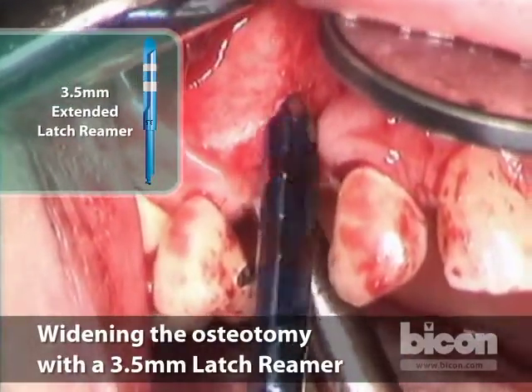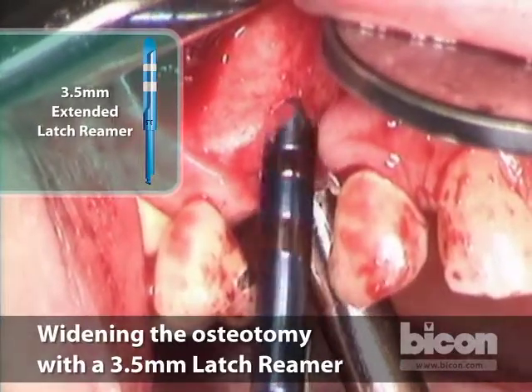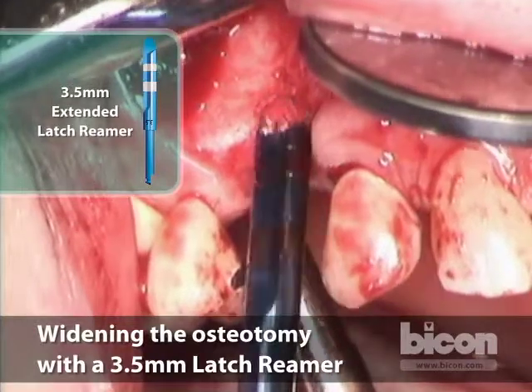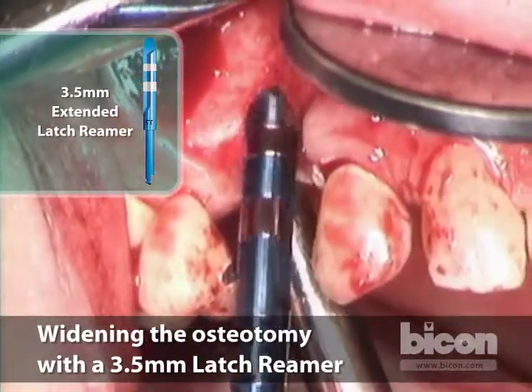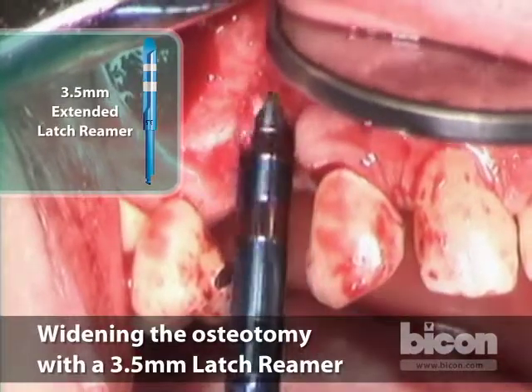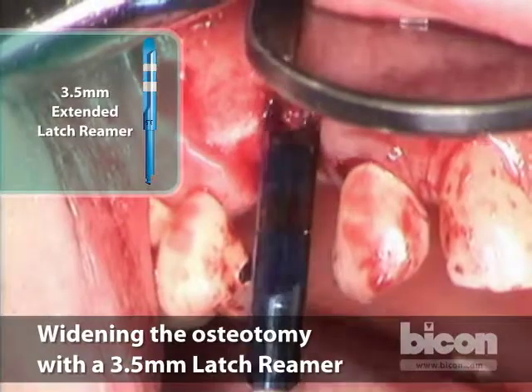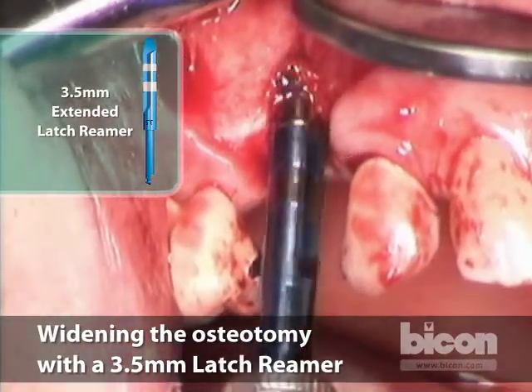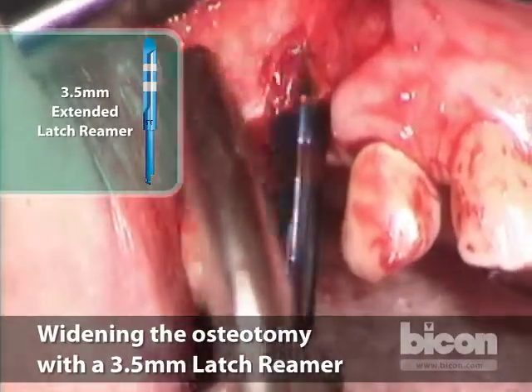The reamers always try to go the path of least resistance. In this case, it's going to be the buccal, as that's the plate that offers the least amount of resistance. And in fact, that's fine. Suction on the buccal in the distal part. Good, come out. That's where we are anticipating we will want to go. Suction, please. Good.